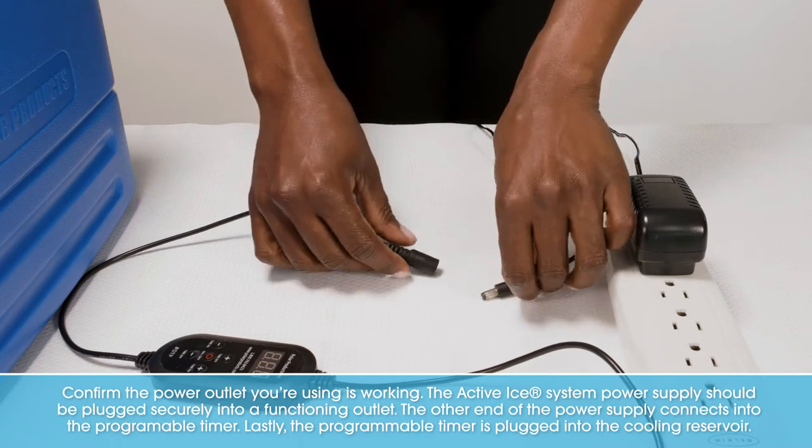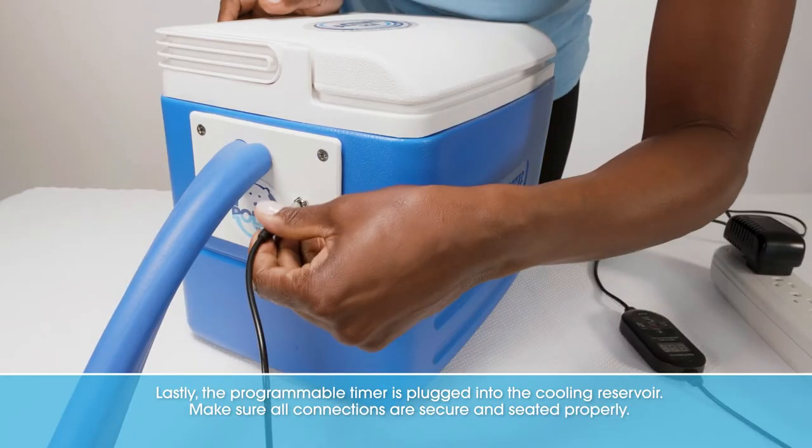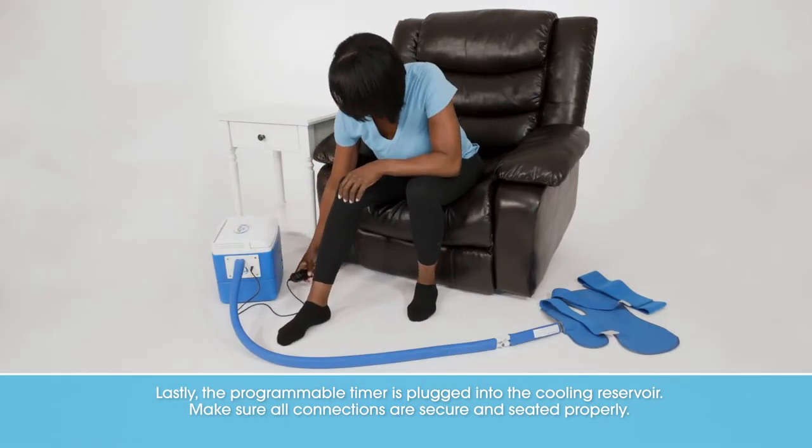The other end of the power supply connects into the programmable timer. Lastly, the programmable timer is plugged into the cooling reservoir. Make sure all connections are secure and seated properly.